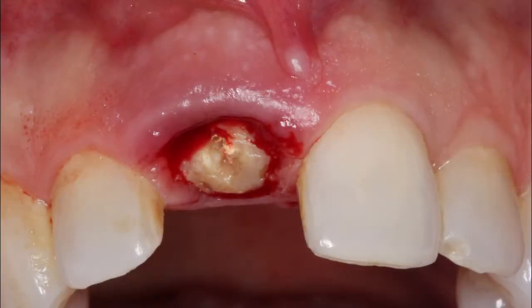Figure 3 demonstrates the clinical crown being removed using simple finger pressure. This revealed a compromised root structure. Note the inflammation of the surrounding tissue due to the movement of the horizontally fractured tooth.